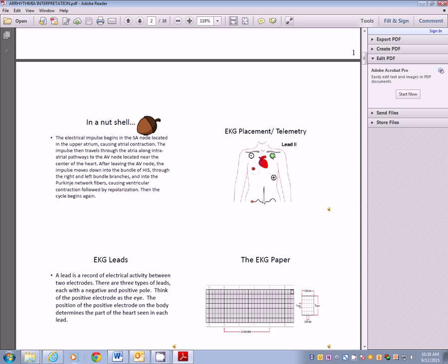Another phrase is smoke over fire. Red being the fire, black being the smoke going over the fire. So those are some little things just to help you. So white to right, red to ribs, smoke over fire. So hopefully that will help you a little bit on what colors go to what.